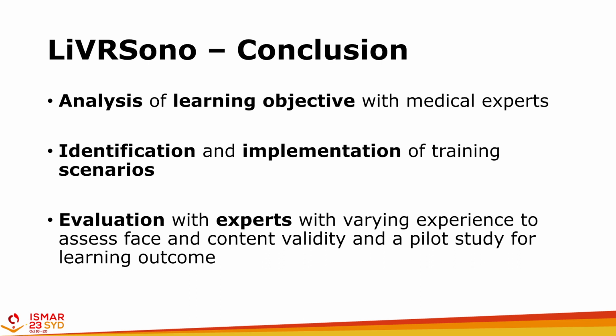In conclusion, we analyzed the learning goal and intraoperative workflow in close cooperation with medical experts. Then we identified and implemented 4 training scenarios, whereof 3 were rated as meaningful and effective. Finally, we evaluated the prototype with experts with varying experience to assess face and content validity, and a pilot study for learning outcome.